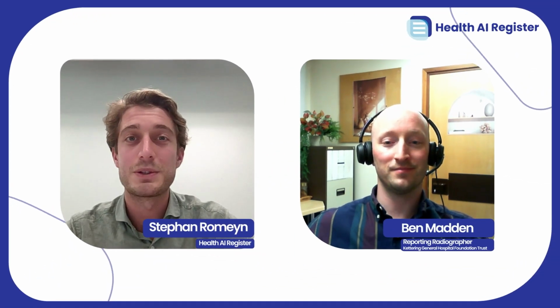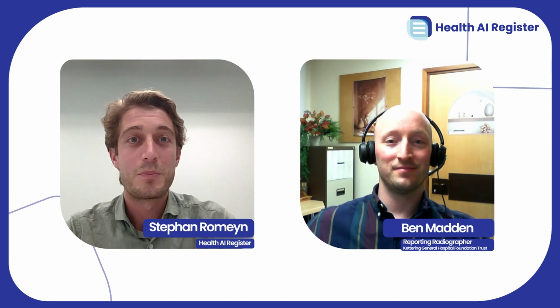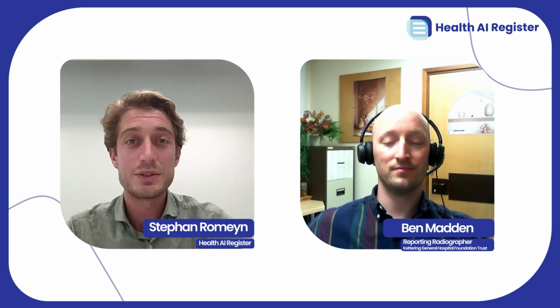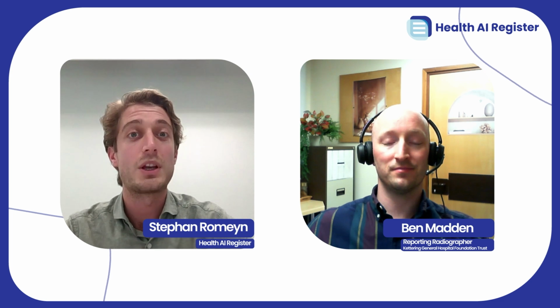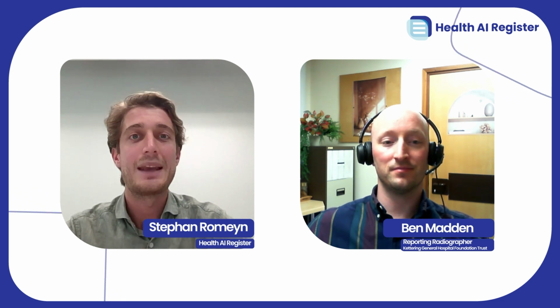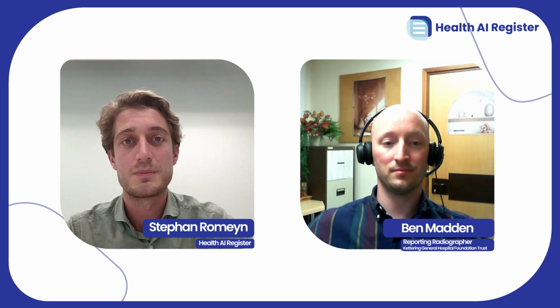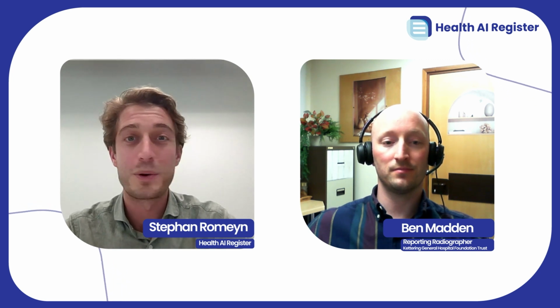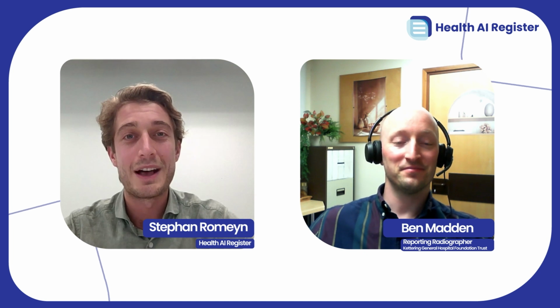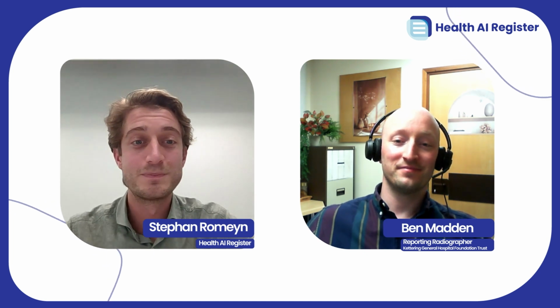And today we welcome Ben Madden from University Hospitals of Northamptonshire. Ben has already been using this product for several years in his clinical practice. In this video, together with Ben, we will go over the adoption process, his experiences, and also a small demo of the product, and the impact he sees in clinical practice. So thanks a lot for being here, Ben. Can you give us a brief introduction about yourself and your role within the department?